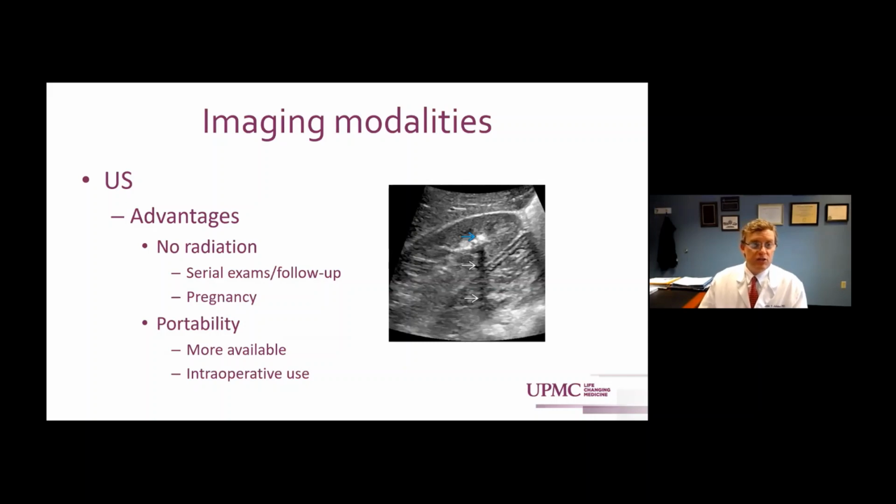Ultrasound, the advantages, of course, are that there's no radiation at all. It's great for serial exams. It's great for follow-up where you've got a CT scan, you know where the stone is, you know how much hydro or what else you expect to see, and then the ultrasound looks at it and you say, is it gone? Is it better? Certainly pregnant patients, ultrasound's always going to be your primary consideration. This isn't really talked about imaging in children, but that's almost always going to be the choice in children as well. Ultrasound's more portable. It tends to be more available sometimes. You can even use it intraoperatively, which is very helpful.